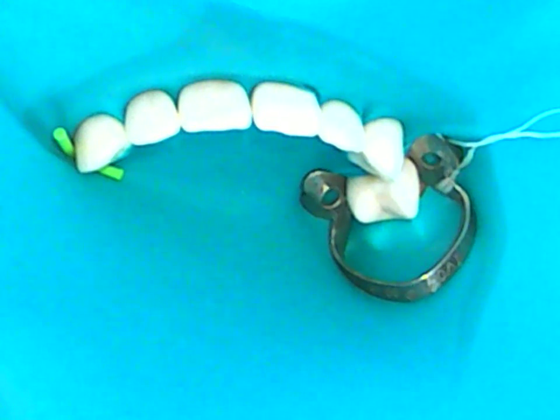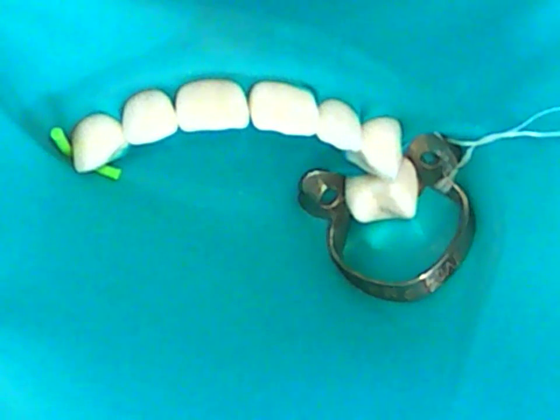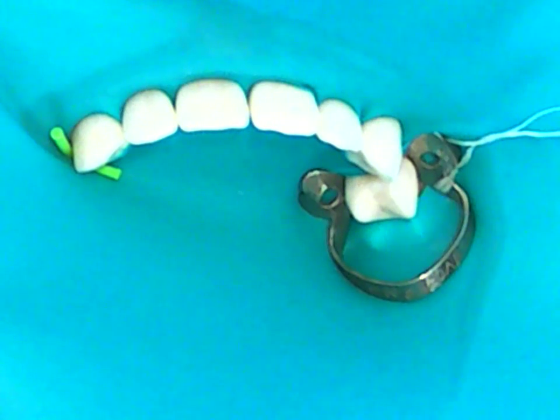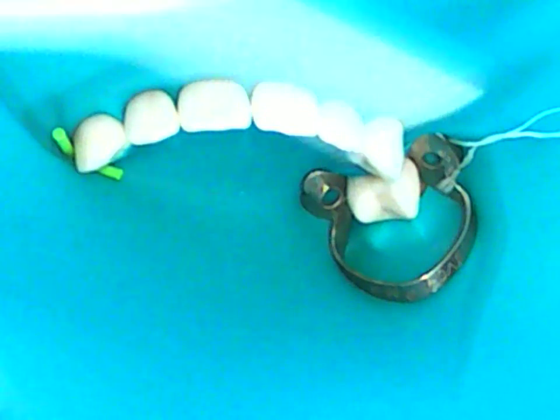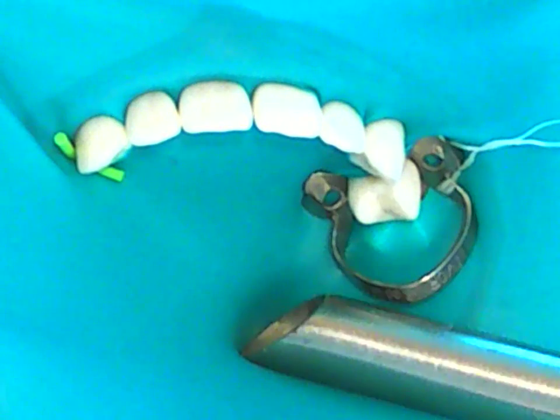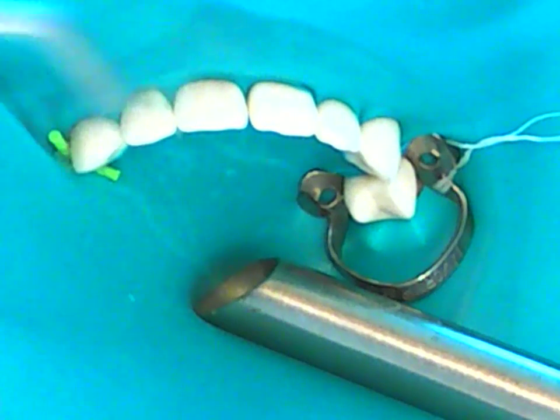Okay. Once the restorative treatment is completed and it's time for removal, we want to ensure that there's no debris left on the dental dam prior to removal. So we most often would provide a rinse with the high volume evacuator in the area that we worked on and just clean up the dental dam in that respect. So with the air water syringe in your dominant hand, HVE in your non-dominant hand, you're going to place it, make that little trough.